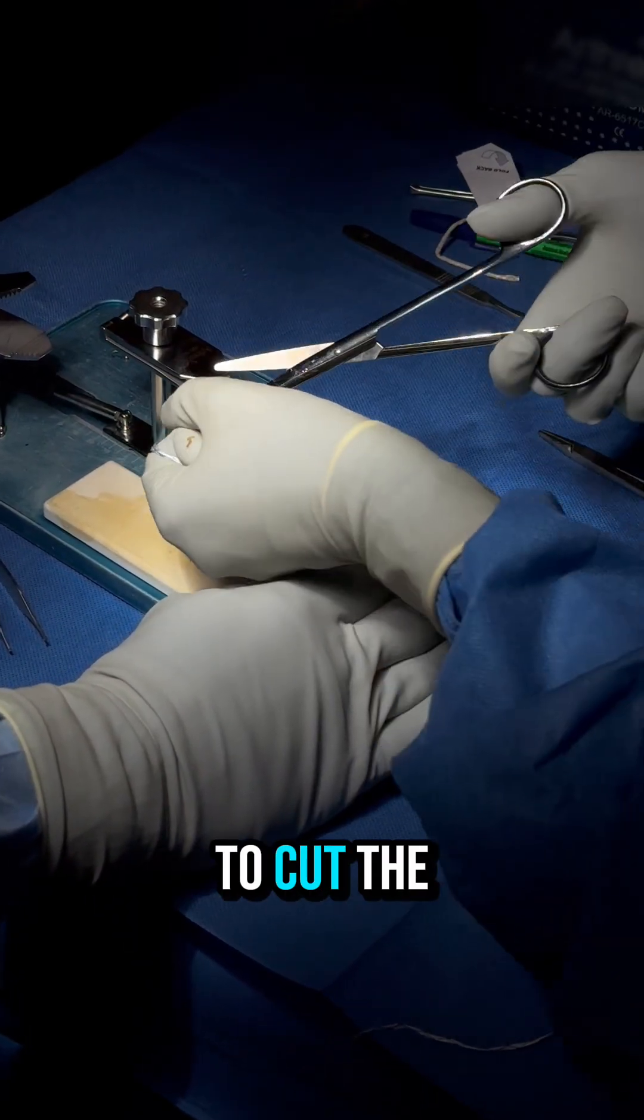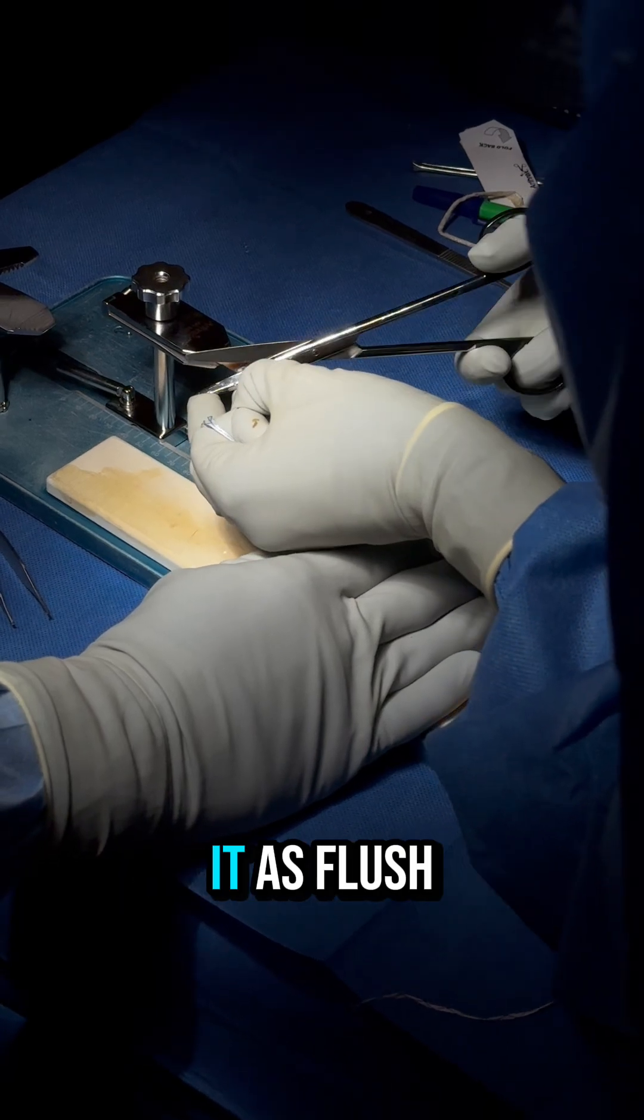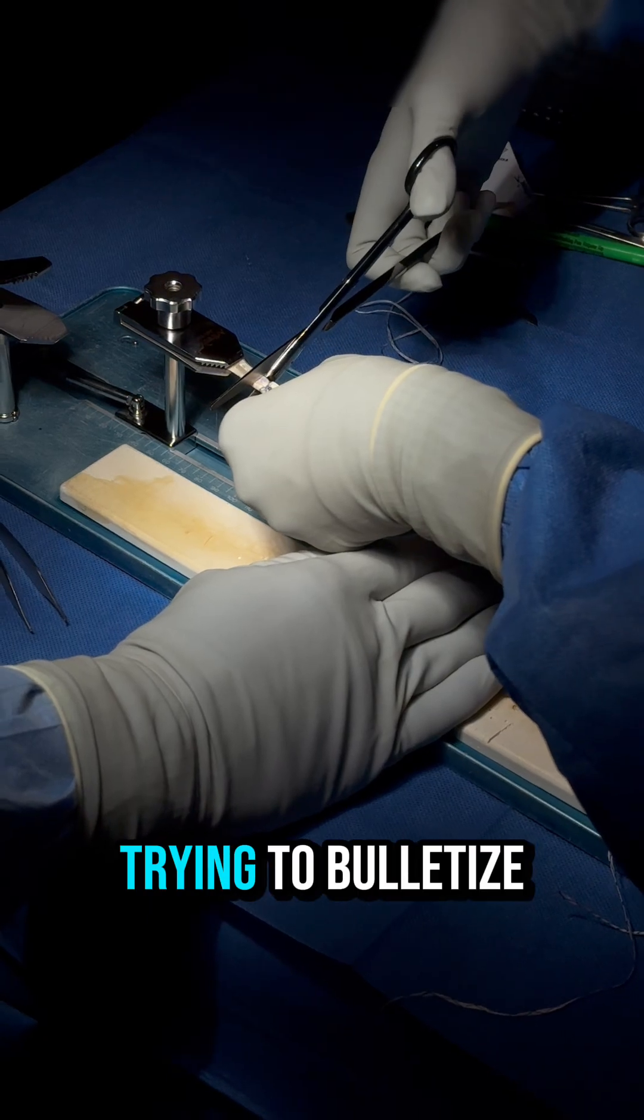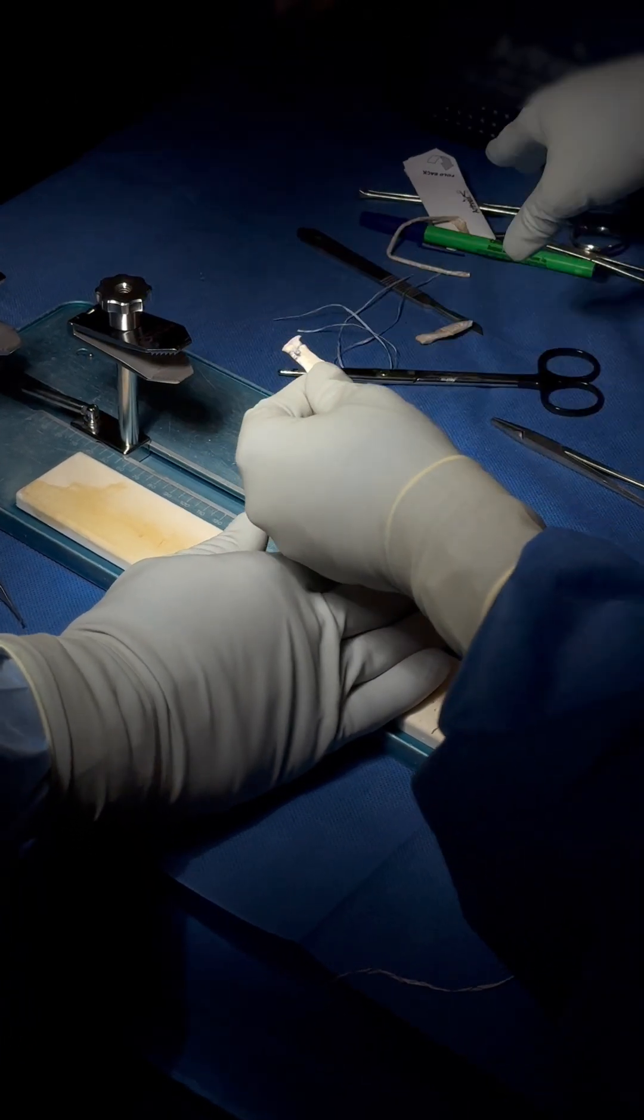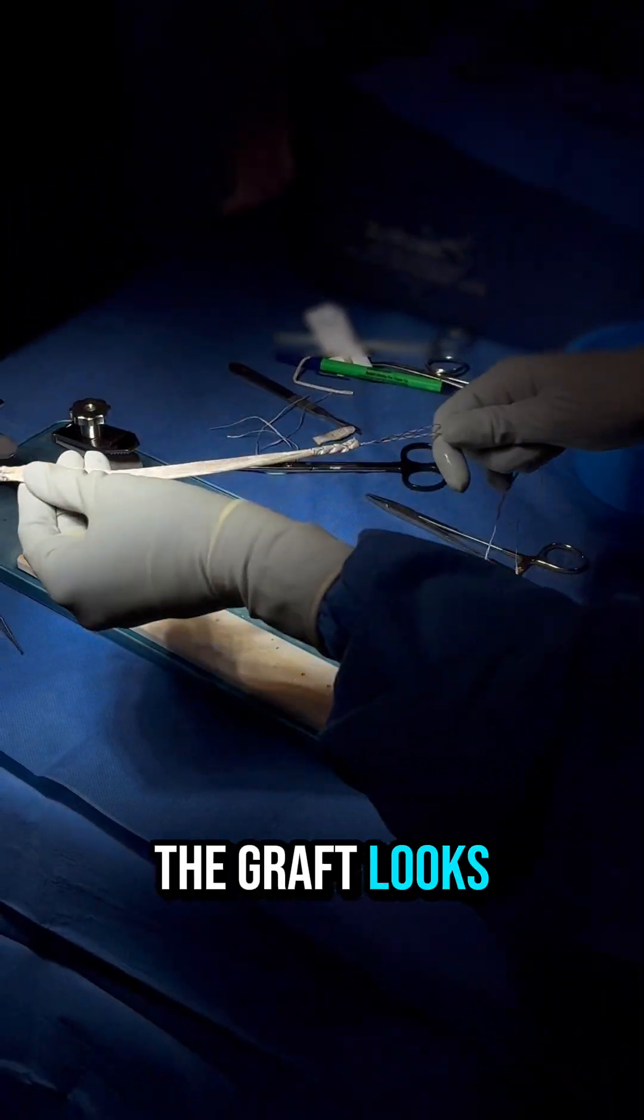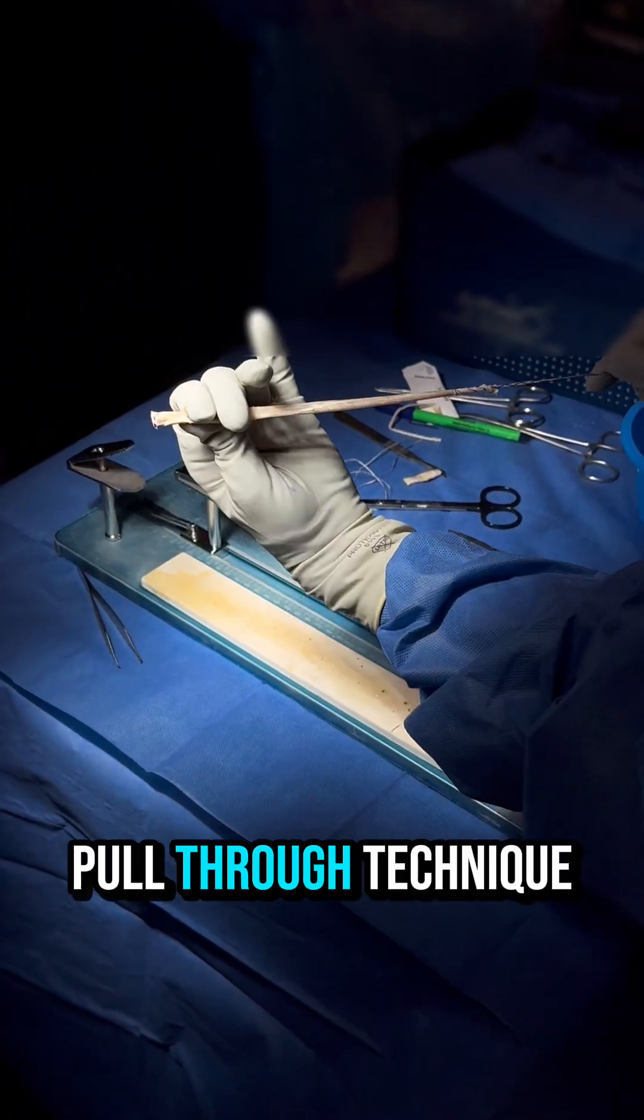Next, we cut the suture ends and make them as flush as possible. Then lastly, we amputate the graft, trying to bulletize it for easy incorporation. In the end, this is what the graft looks like and it's ready for our knotless pull-through technique.